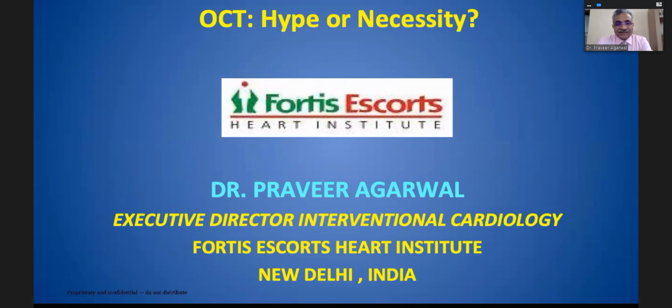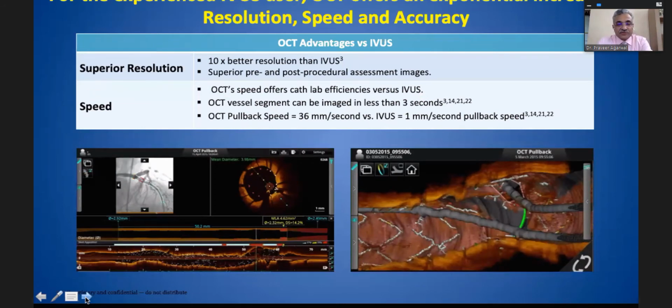So it's a debatable thing. Is it a hype or a necessity? So Naveen has put me at a great point about what kind of message I give in the end. But I tell you the truth about this OCT, which to me initially looked maybe like a hype, but now we realize it is becoming a necessity. For an experienced IVUS user, because all of us have been using IVUS for a long time, OCT offers an exponential increase in resolution, speed, and accuracy that we all know. It's a superior resolution, almost 10 times better than IVUS, and superior pre and post images, and not rocket science. You can have some experience and you can just do it very easily.